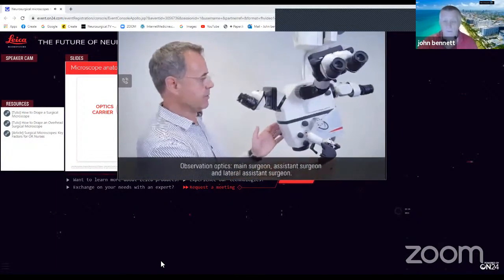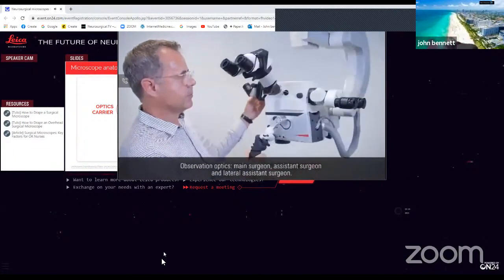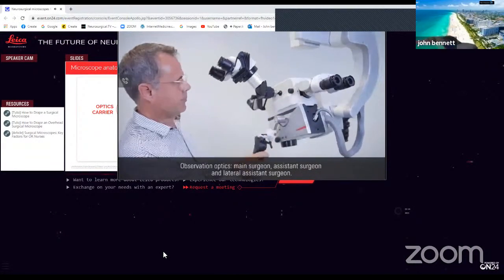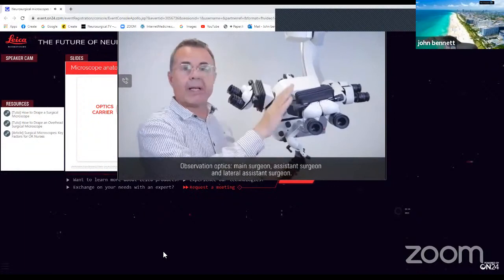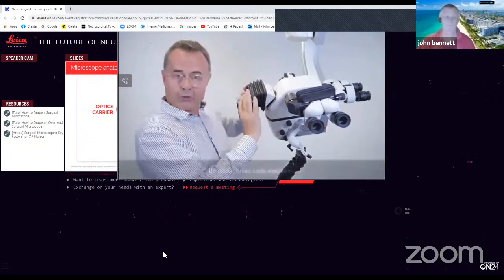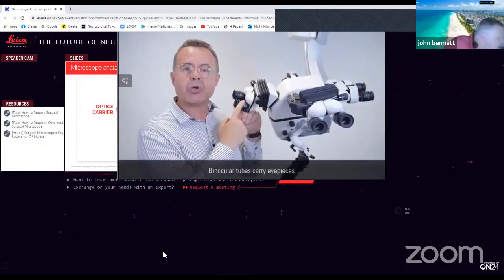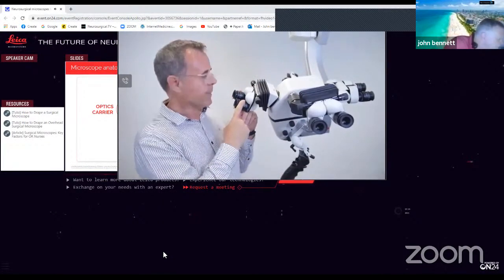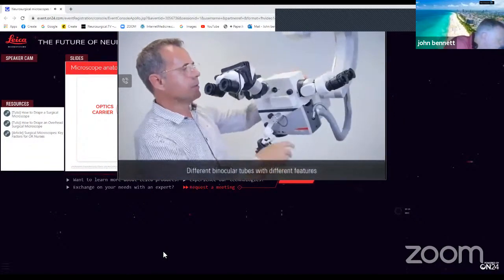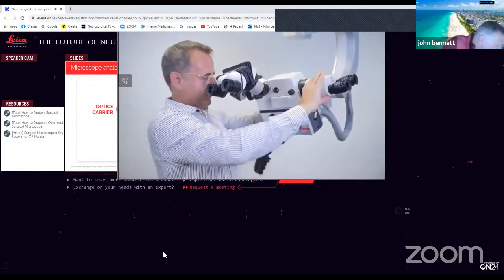Let's start in the front, main surgeon. Let me turn around. Opposite assistant surgeon. And here, lateral assistant. These binocular tubes, that's how they're called, carry eyepieces. There's choices. Look them up, okay? We have different binocular tubes. That means different features.